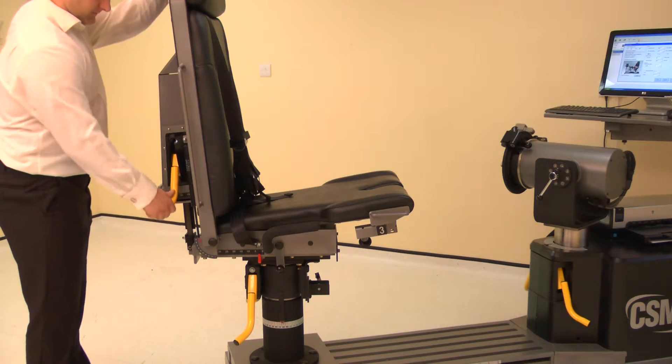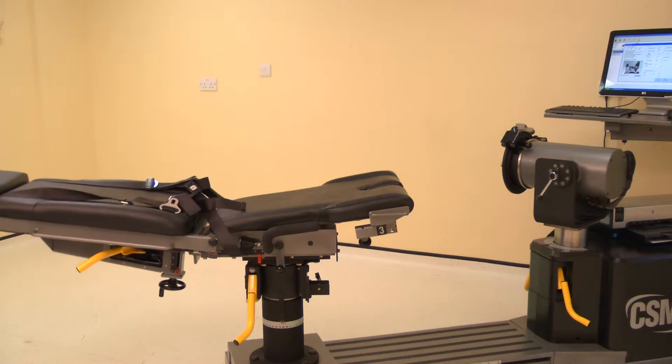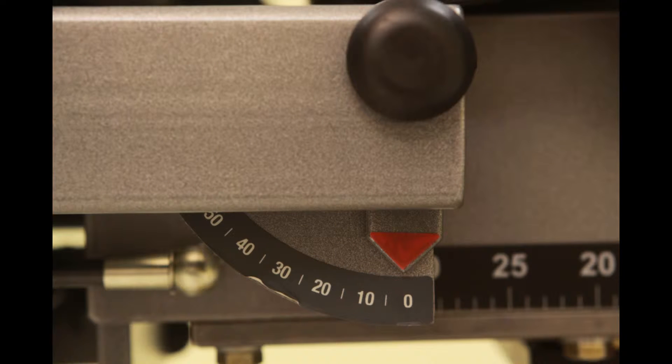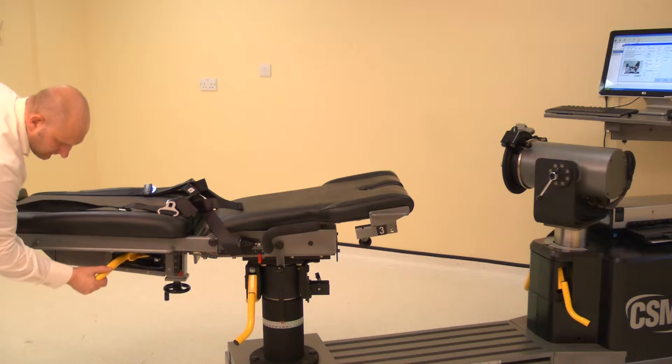To set the chair back angle, lift the locking handle and adjust the chair back. For the prone knee position, adjust the chair back angle to 0 degrees. Ensure both locking handles are pushed down to secure.